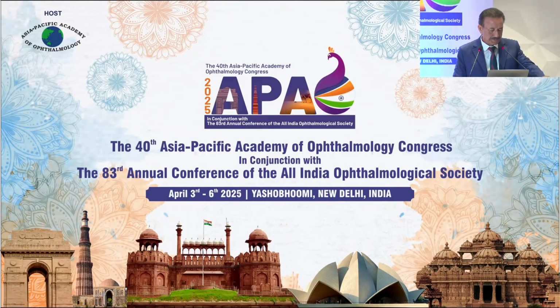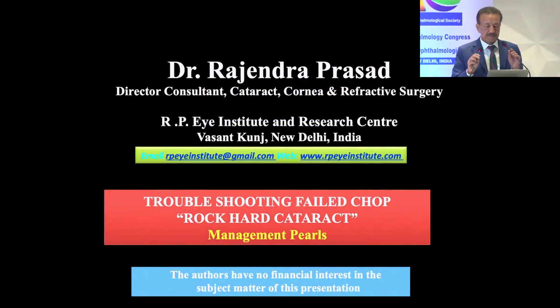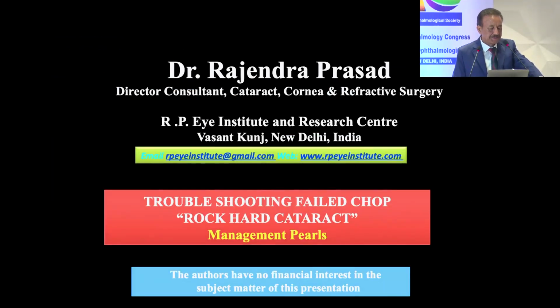Meanwhile, we can have a question to Dr. Sudhang Bharti. Dr. Bharti, do you increase the energy while you are doing femtosecond laser cases? No, it's the same energy level. I don't think we need to increase that; it actually increases the turbulence. Okay. Thank you.